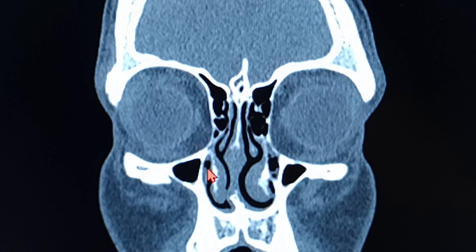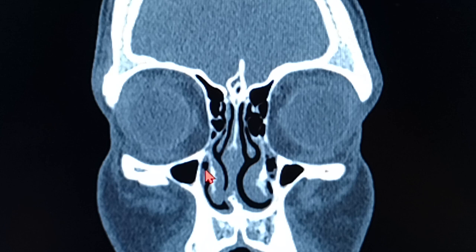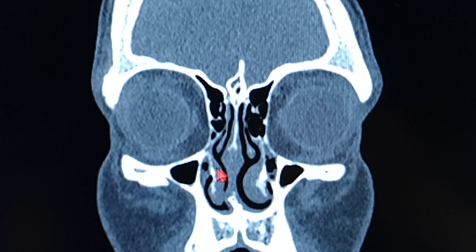Now, what is next? We finished off the frontal anatomy. We finished off the nasolacrimal duct system on the coronal scan. The third most important thing should be, I'll go with the nasal structures. So the septum we can see over here, that's the perpendicular plate of the ethmoid becoming longer and longer. That's the inferior turbinate. So I'll go with the turbinates right now. Whatever you can see endonasal, intranasal, I'll go with that.